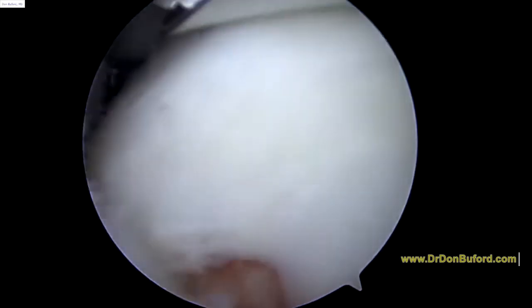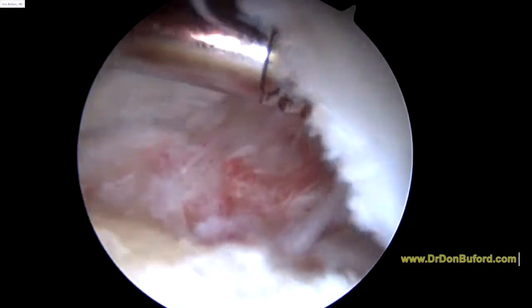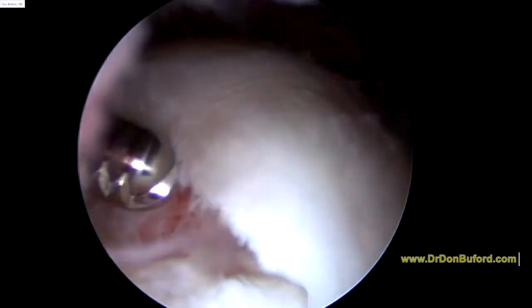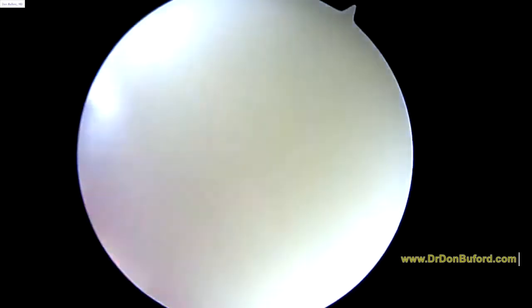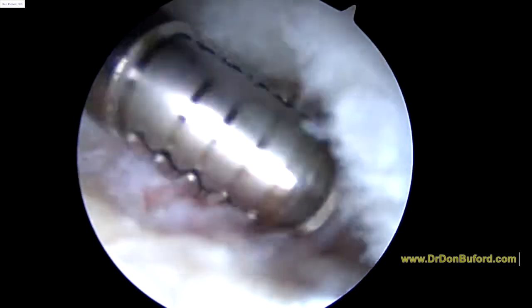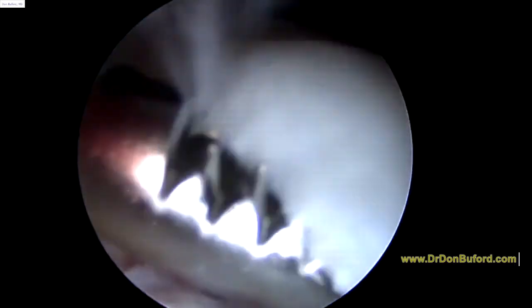Remember, we saw that yellow area from the articular side. Now we're looking from the side still. We're just kind of lifting up on the tendon to see. This is that yellow area that was seen from the articular side right in there. And you can see how the tear extends a bit more posterior here. So that's why I say the damage is always more than it looks initially. But I still think we'll be able to repair this with one suture anchor.